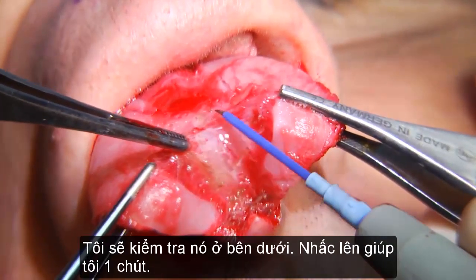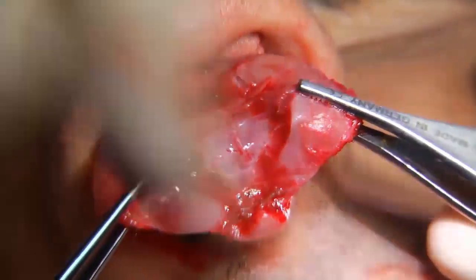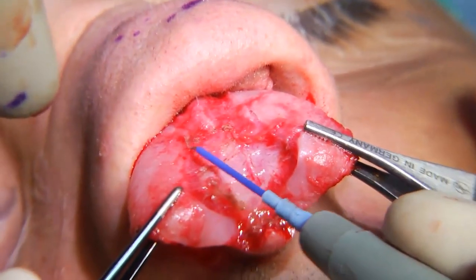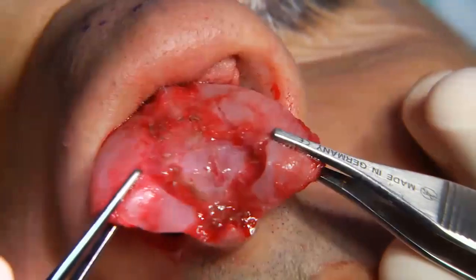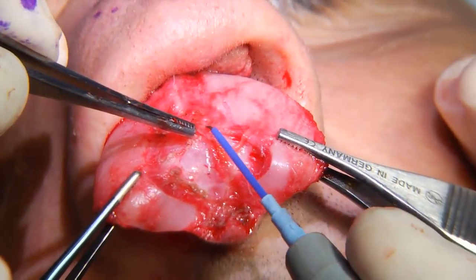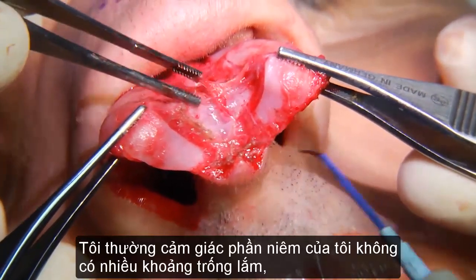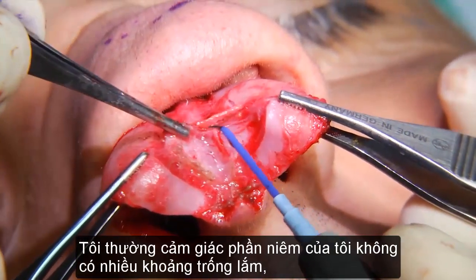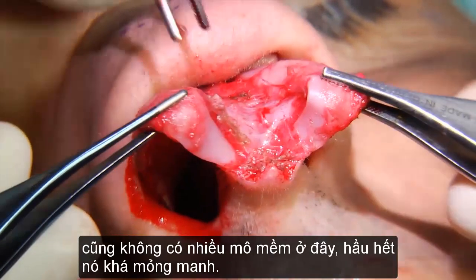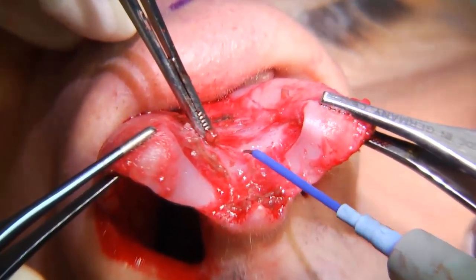So I'm checking it on the underneath. So I'm always feeling my mucosa. Frankly, there's not much space. Doesn't have much soft tissue, frankly. This is mostly kind of flimsy.